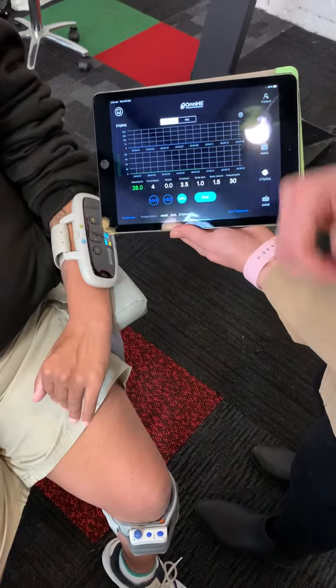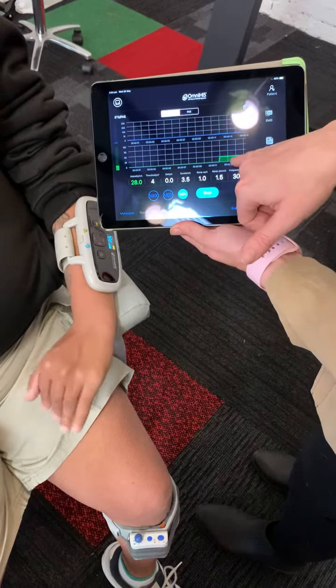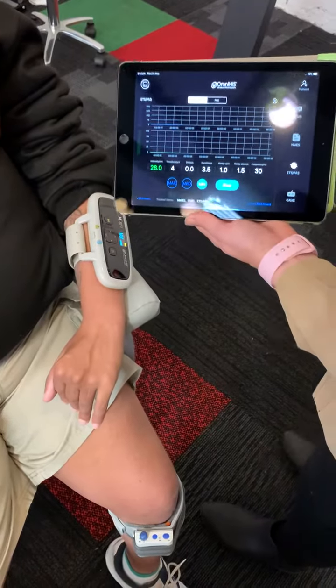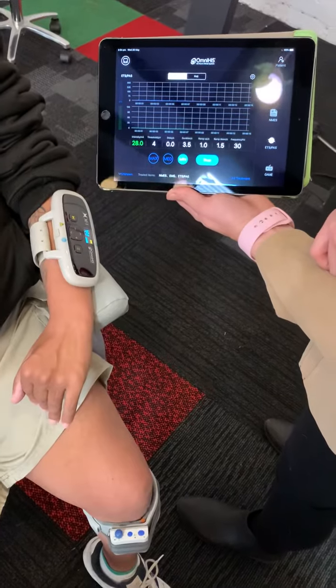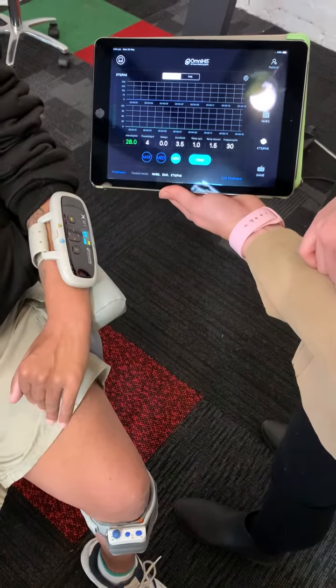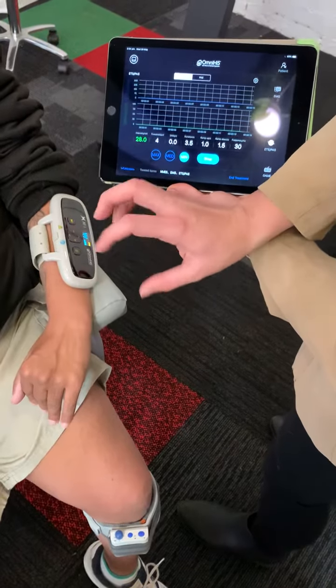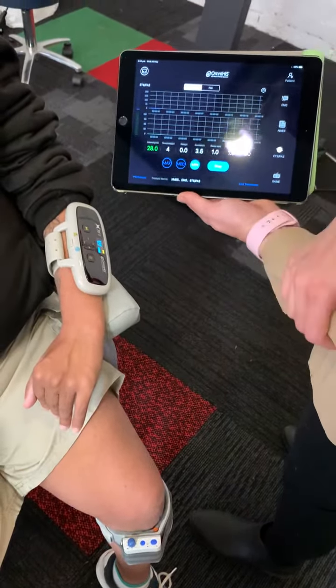If you can give it a good crack — that's the stim. Is this me doing this on my own? Yes. So I'm fighting through all the brain damage that's there and trying to build new pathways? Yes, and then the Omni High Five is picking up what's happening underneath and turning that into a bigger movement.